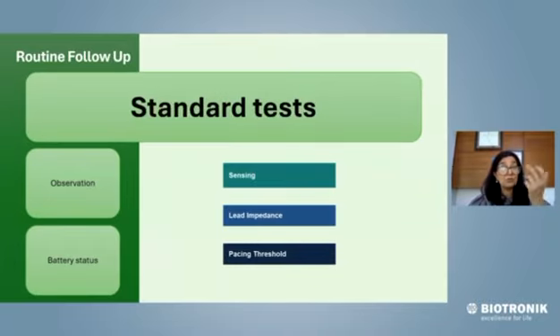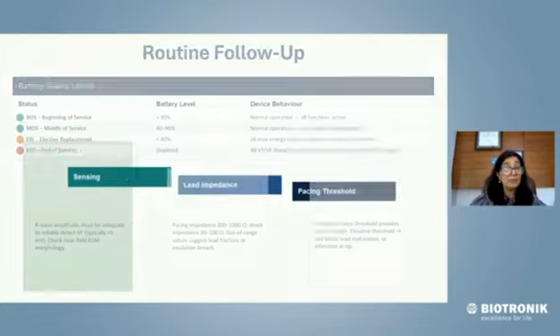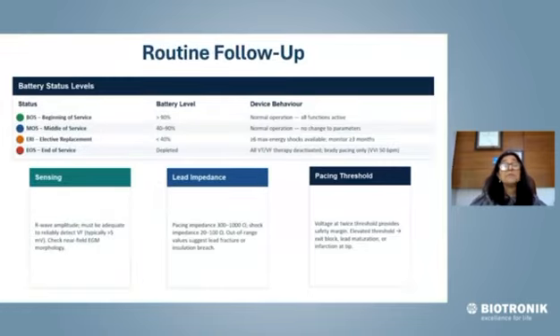And when the patient is there, now you want to troubleshoot. So you want to see what's happening. You look at 3 parameters which are most important: sensing, lead impedance, and pacing thresholds. This is what you would do even for a pacemaker. But this has way more importance when you're doing it in an ICD follow-up. So sensing, I told you, at implant the R wave must be adequate to reliably detect VF, and you want it to be more than 5 millivolts.